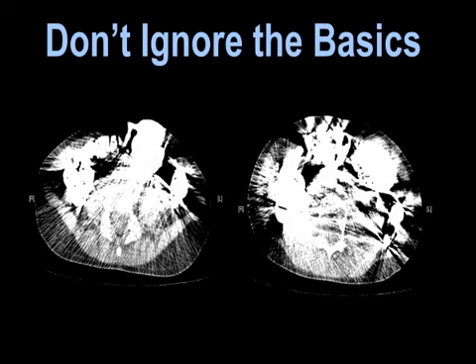So the outside scan comes in, and this is totally wasted radiation. So this is rule out appendicitis. This is a pelvis, for those of you who can't tell. Pelvic bones are down there. So it's sort of a crime. You look at this, and it is funny, but it's kind of sad.